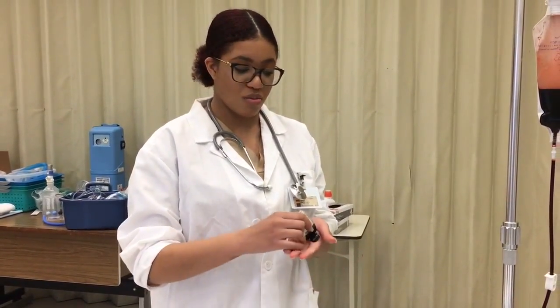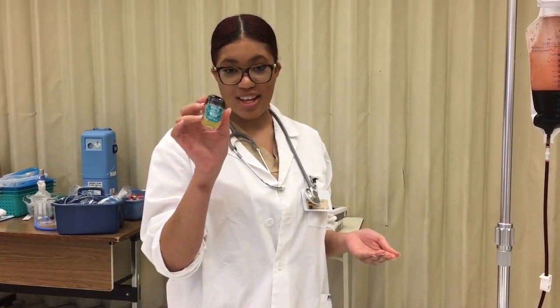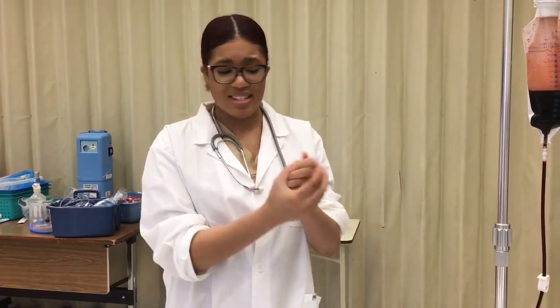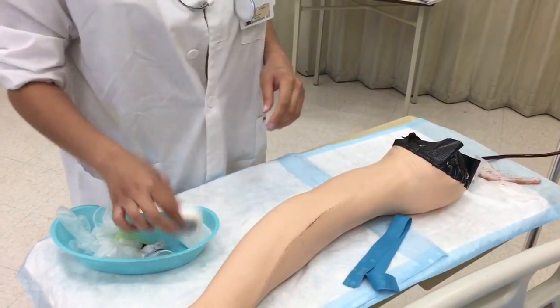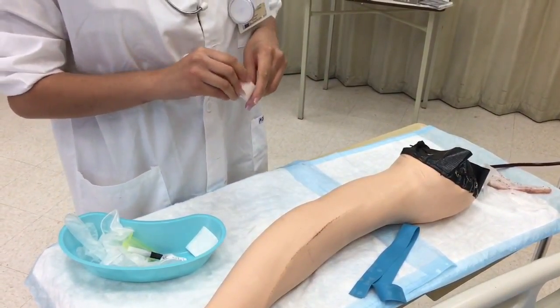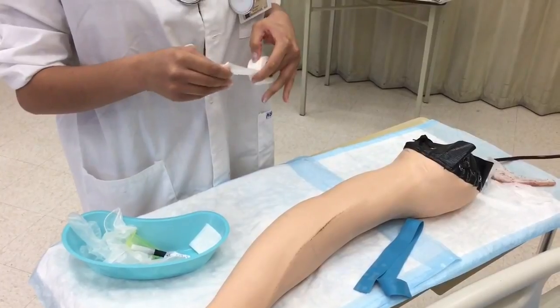I've gathered all of my materials and I'm now in the patient's room. Before touching anything, the first thing I'm going to do is hand sanitize. In a hospital you'd have the big bottles of hand sanitizer, but we're in the lab, so I'm using what we have here.